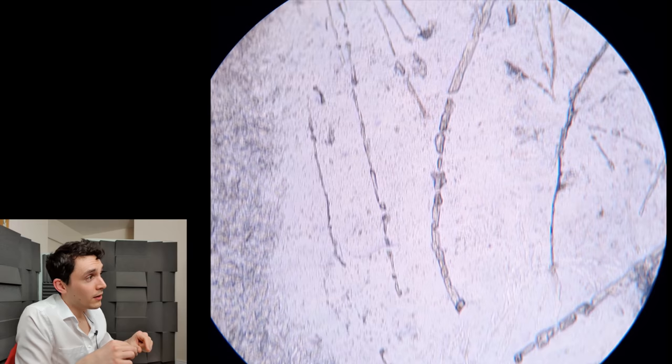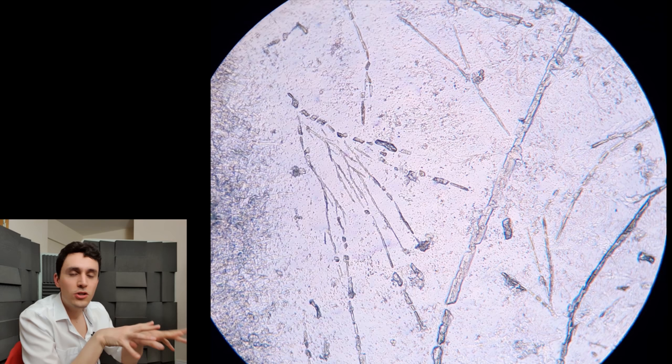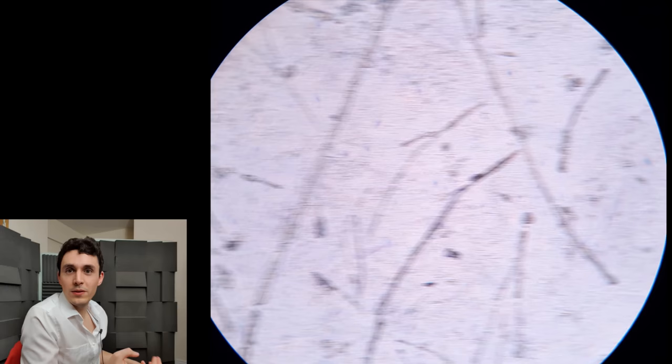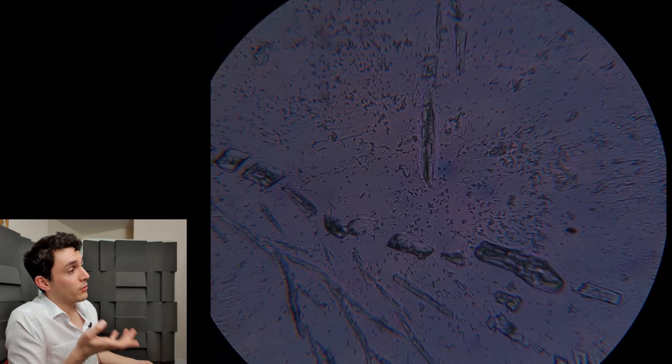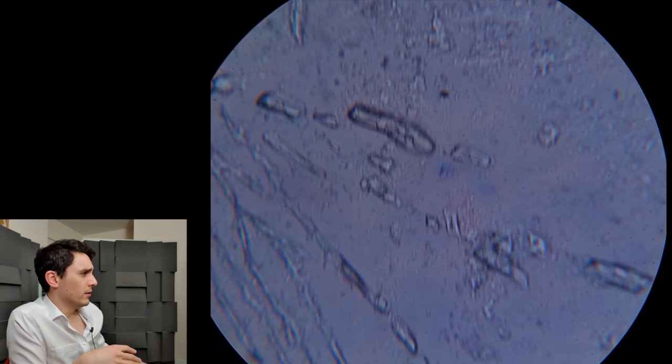There is a very good example here. You see on the left-hand side of the image, it almost looks like roots of a tree or branches of a tree projecting out in these V shapes. That is typical of a type of fungus called Aspergillus, which is not a surprise — Aspergillus is known for causing otomycosis, which is a fungal ear infection. It's often described as branching out in these V-like projections.